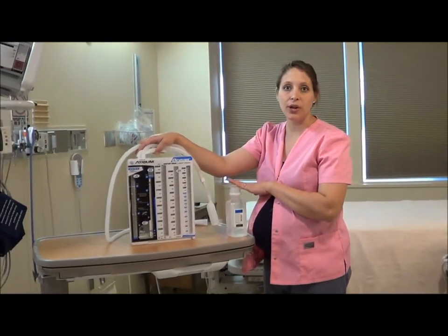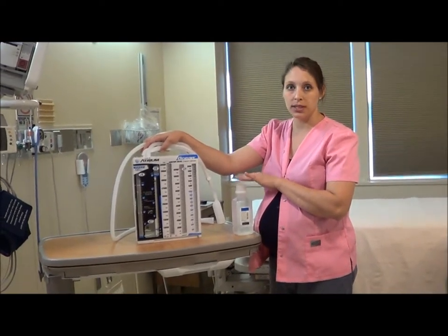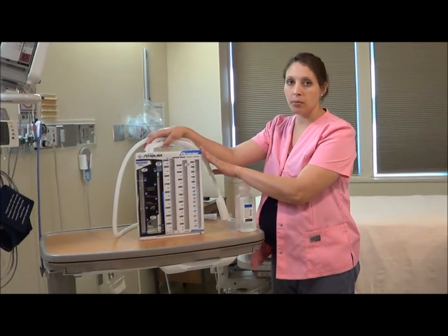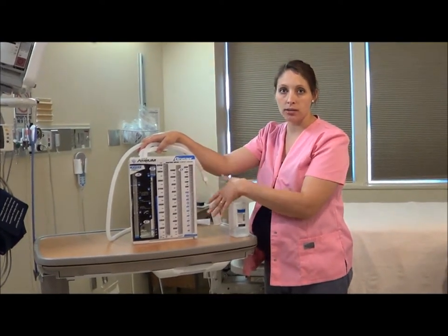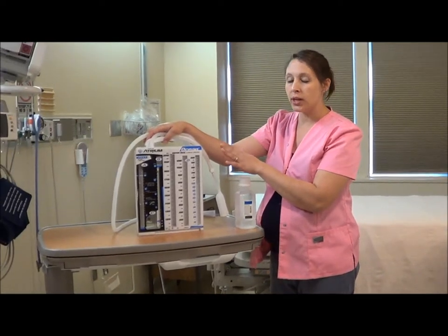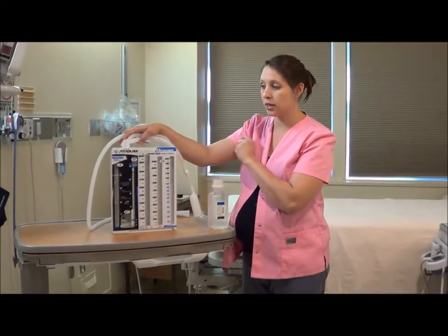Welcome, I'm Amy and I will be going over how to set up the Ocean Atrium Chest Tube System. This comes in a sterile package with a sterile OR towel around it. If you're in the OR and this is the first setup, just expect it to be in that blue sterile packaging.